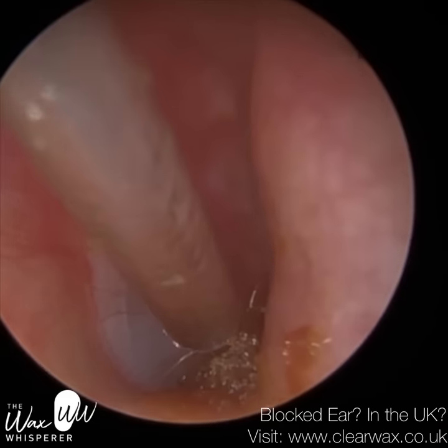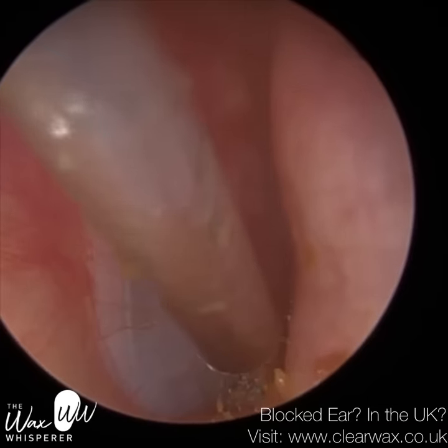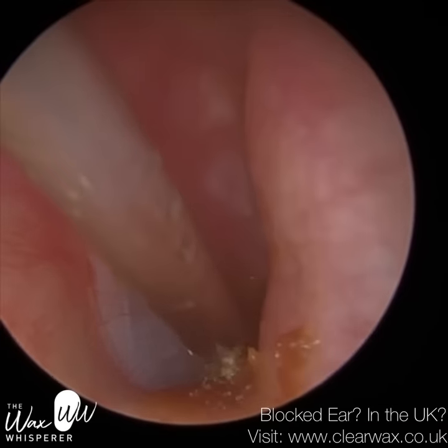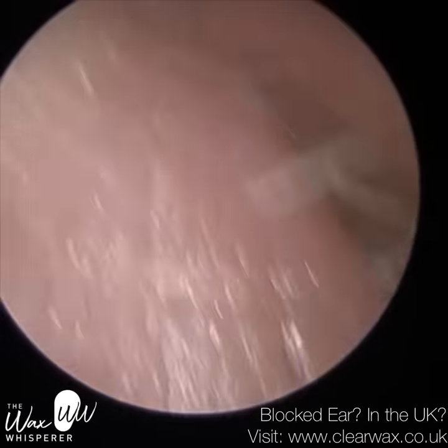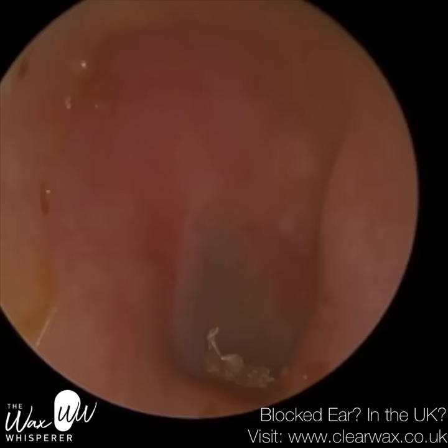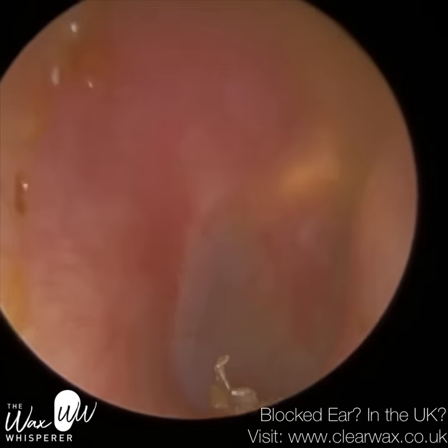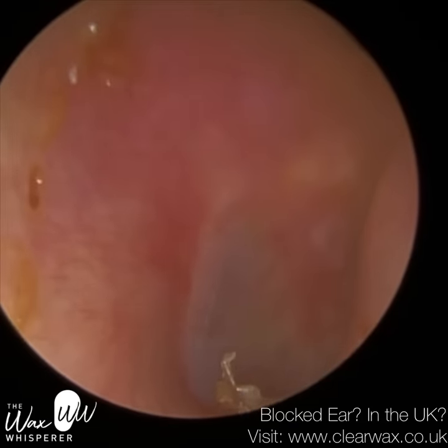So the wax scope, like an ENT microscope, has a speculum, which is a black plastic funnel, which is hollow. It's wide at one end, tapers at the other end, and the tapered end goes into the ear, and you can use the speculum instead to straighten the ear canal and widen it. But that inhibits some of the view, but it's still very, very good.